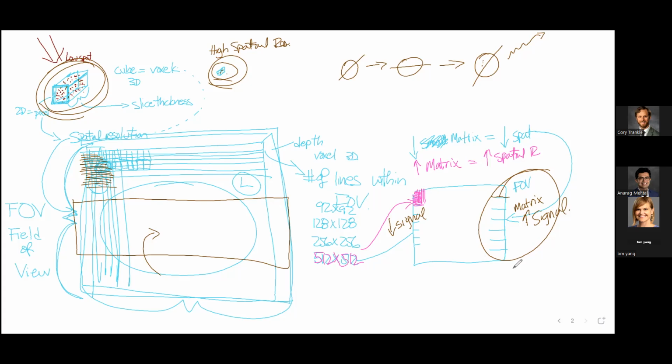It's 80% myocytes, 20% other stuff when you're 20 years old. As we get older, that ratio changes. The T1 changes as you get older over time, okay? It's non-specific. Something's wrong with the ratio. The myocyte to extracellular space ratio is perturbed. It could be because there's water there. It could be because there's collagen there. It could be because there's more reactive fibrosis. There could be interstitial fibrosis.